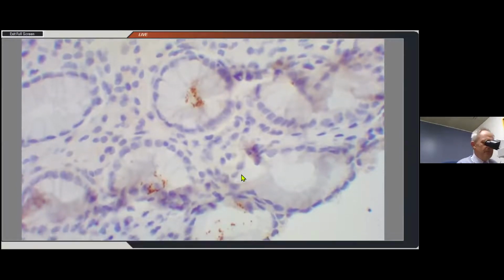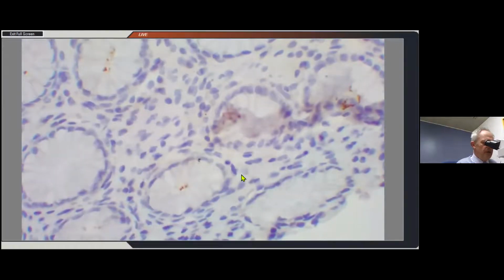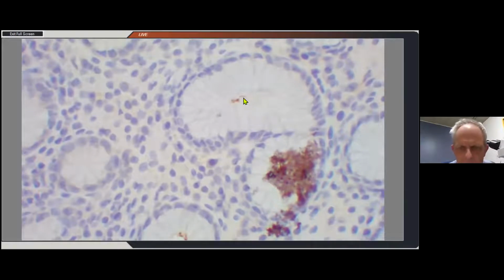The problem comes in separating out the so-called coccoid forms, but the coccoid forms are really supposed to be found more in an intracellular location rather than in the lumen. So there, I think, for example, there's a bacillus there. Okay, so that's a nice example then of active chronic Helicobacter pylori gastritis. Thanks very much, Martin. We see this so often, and it's wonderful to see the histopathology.